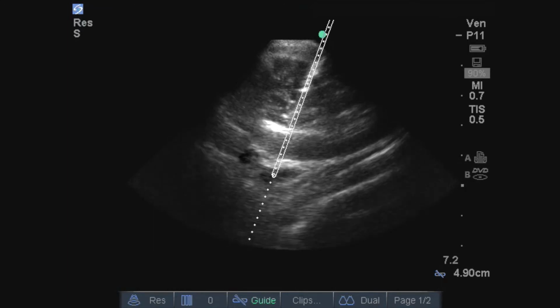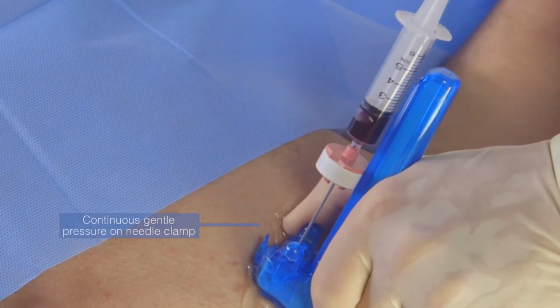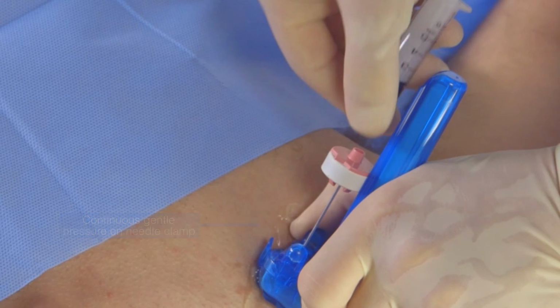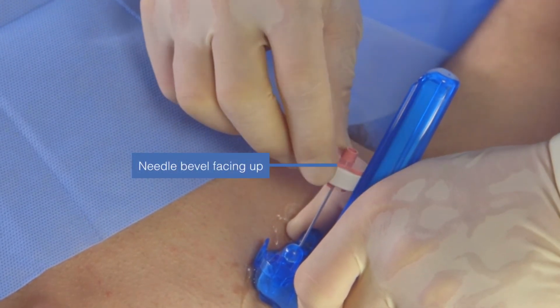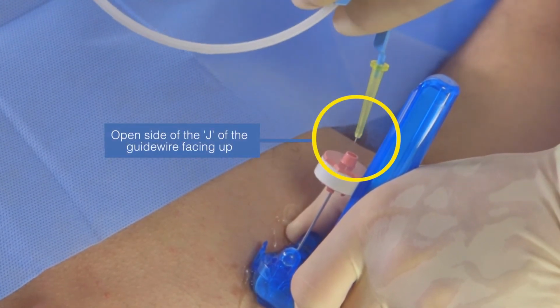Now adjust the needle tip so that it is in the upper half of the lumen and actuate the needle clamp to secure the needle tip in place. While holding pressure on the needle clamp, pop the syringe off the needle by pinching the space between the syringe and the needle hub. Check that the needle bevel is facing up, and with the open side of the J of the guide wire also facing up, advance the guide wire.